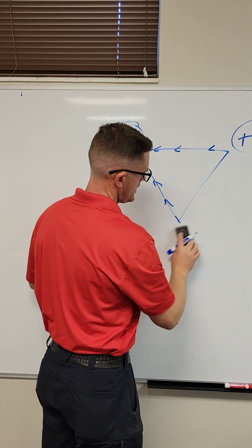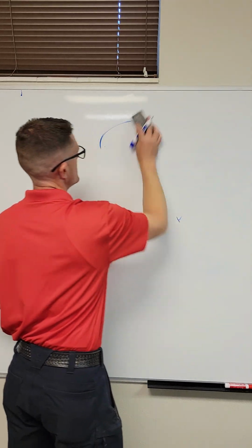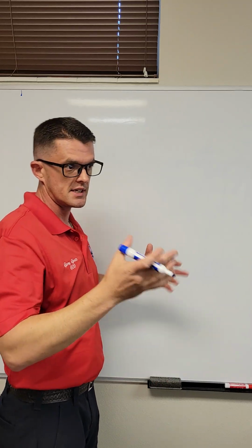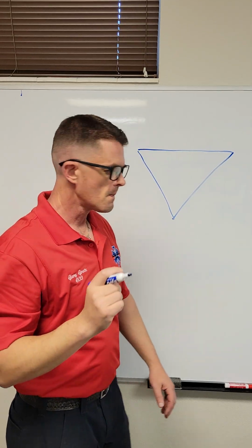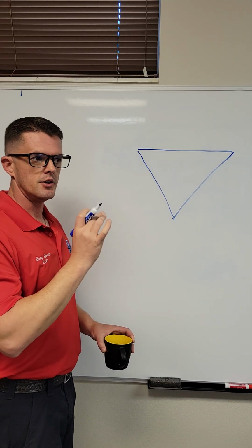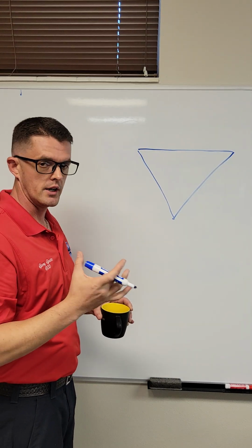Now, one other thing that I want to add on to this is that with your fancy monitors, your $30,000, $40,000, $60,000, whatever they are now, your monitors will actually take the triangle that you've created. Your monitor has created the Einthoven Triangle, giving you an environment.